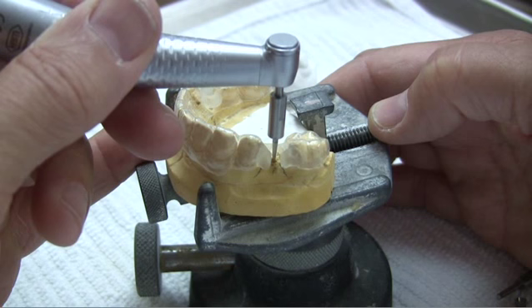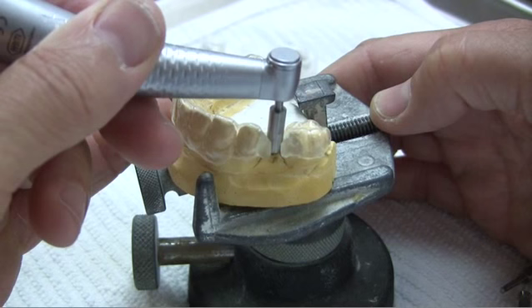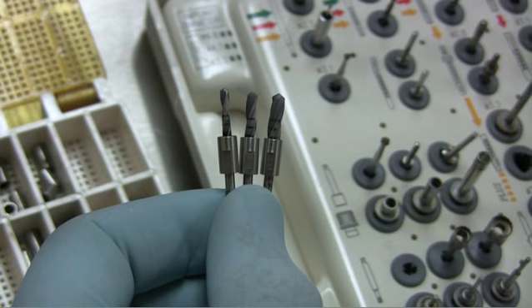This greatly aids in the posterior area of the mouth and is usually not incorporated with anterior guides. The opening formed with the round burr can be easily found with the tip of your pilot burr. As you proceed with drilling depth, the stop will engage the guide and control the axis of the osteotomy. Drill 4 or 5 millimeters and take an x-ray to verify you are in the correct axis.